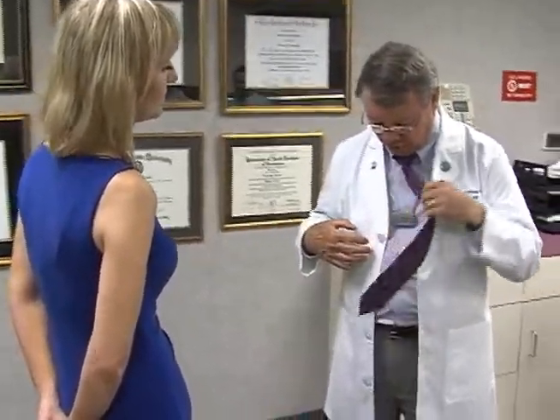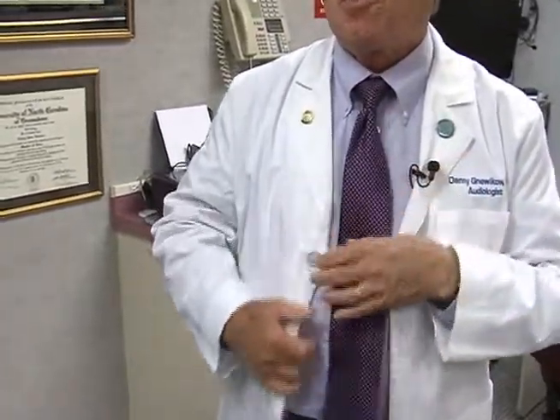Bluetooth is revolutionizing hearing aids in many ways. In fact, under my tie, discreetly hidden, is a Bluetooth streamer. So if I get a call on my telephone, I don't have to take it off of my belt anymore. I simply touch the streamer and I carry on a conversation through my hearing aids. And I think that's very helpful as well. So a lot of things have changed.